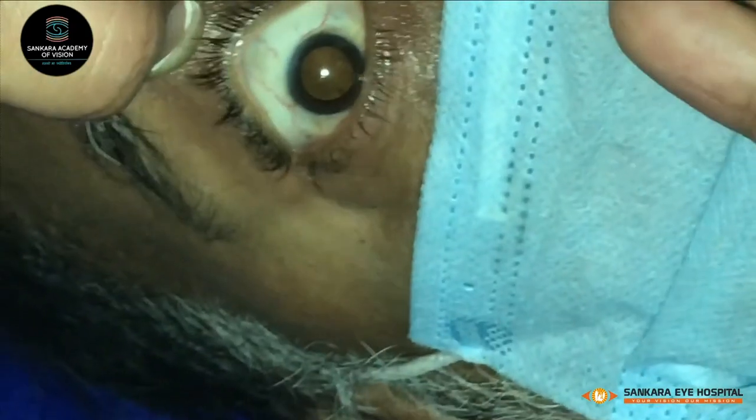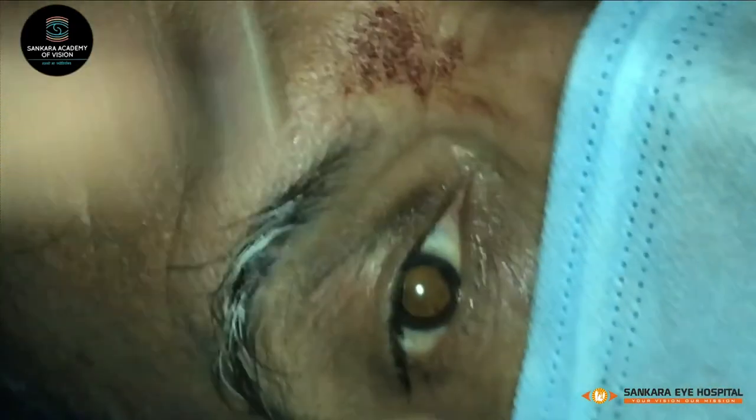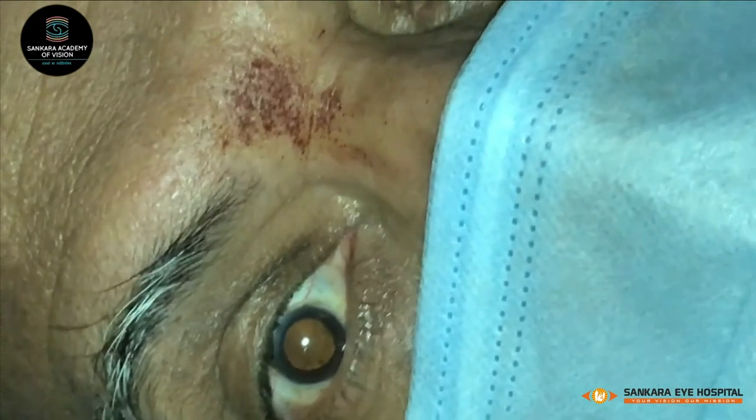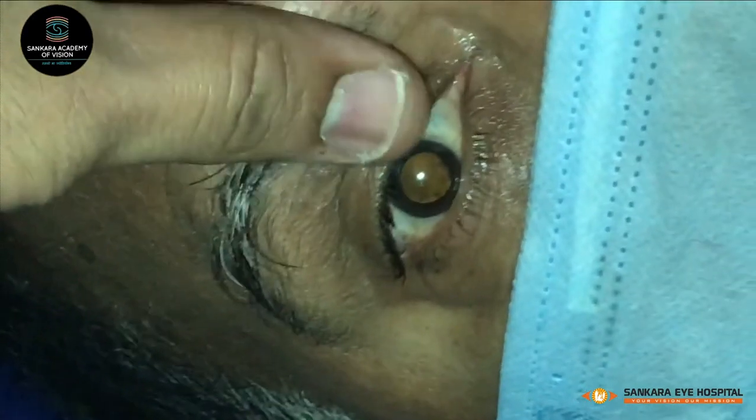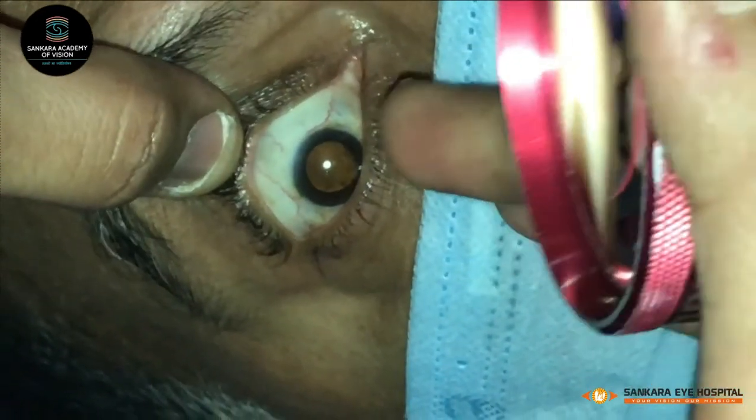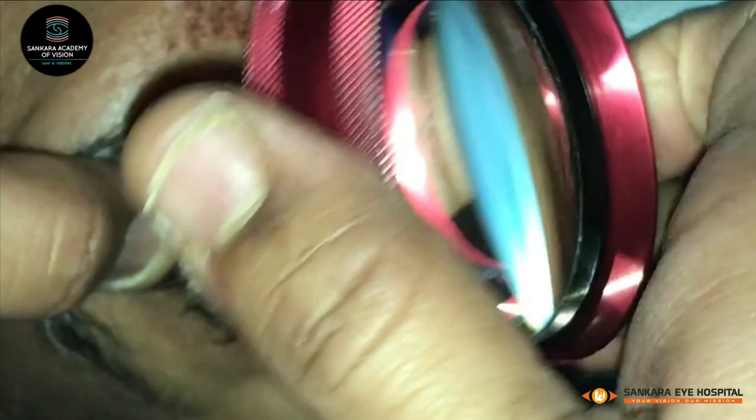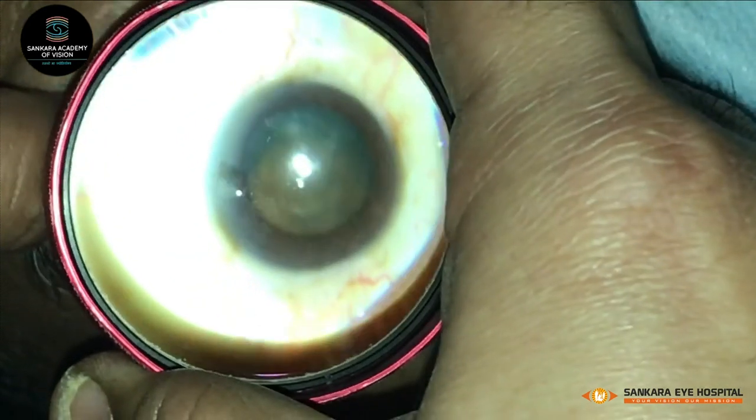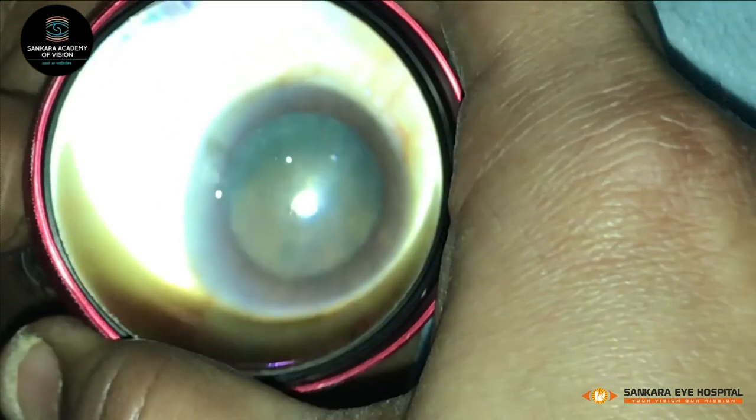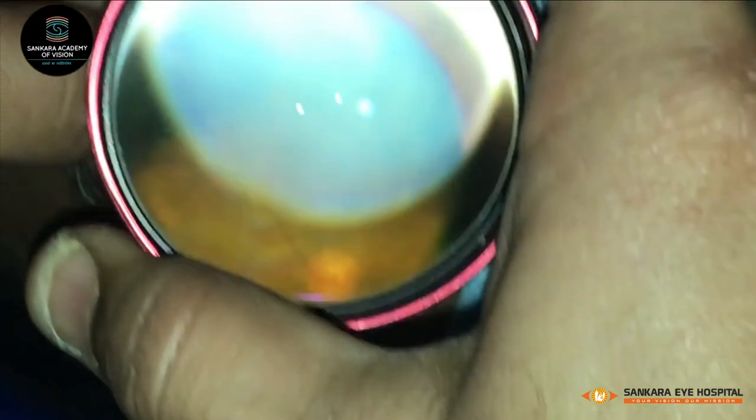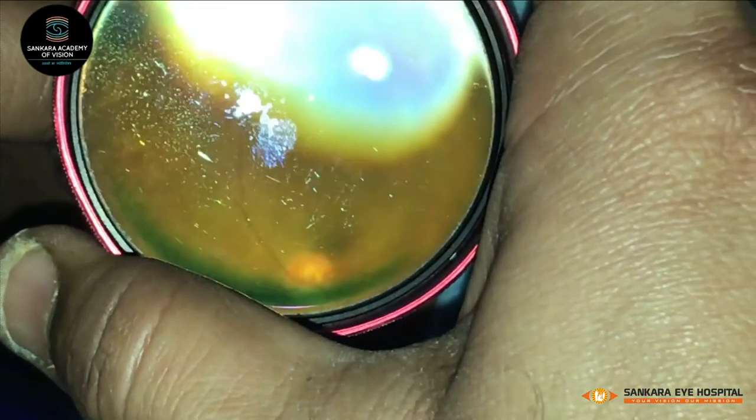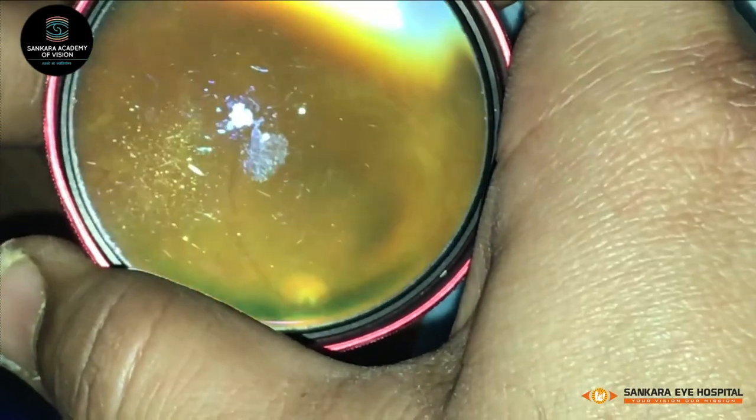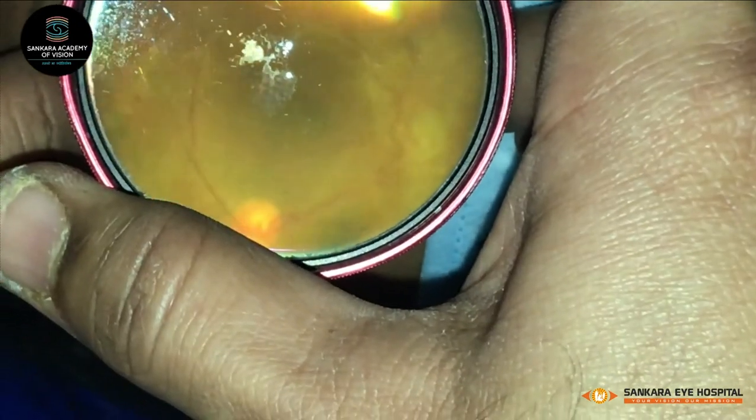Start with minimum intensity. The patient's both eyes should be opened while examination. Throw light into the patient's eye from an arm's distance and observe for red reflex. Interpose the condensing lens in the path of the beam of light, keeping a watch on the reflex close to the patient's eye. Slowly move the lens away from the eye until the image of the retina is clearly seen. This is usually at the focal length of the lens.